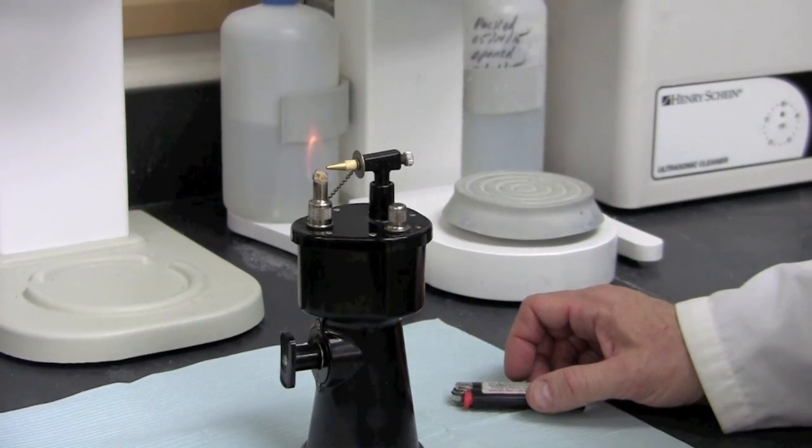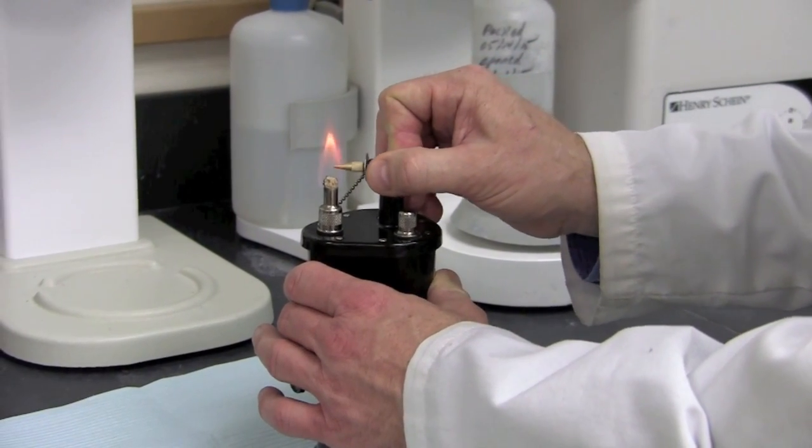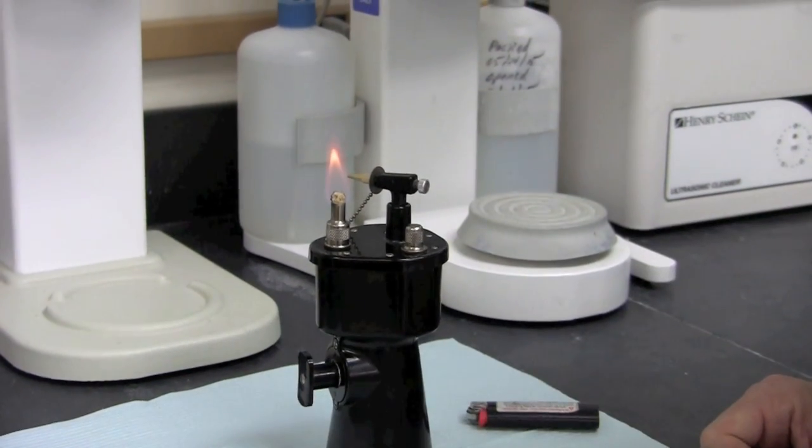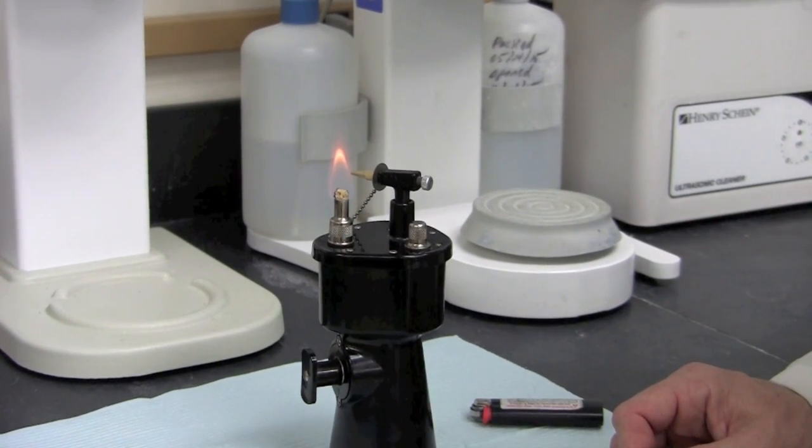If you want to use the torch as an alcohol lamp, simply turn the nozzle assembly to the left or to the right. Then you can warm and soften wax, or whatever material is needed.